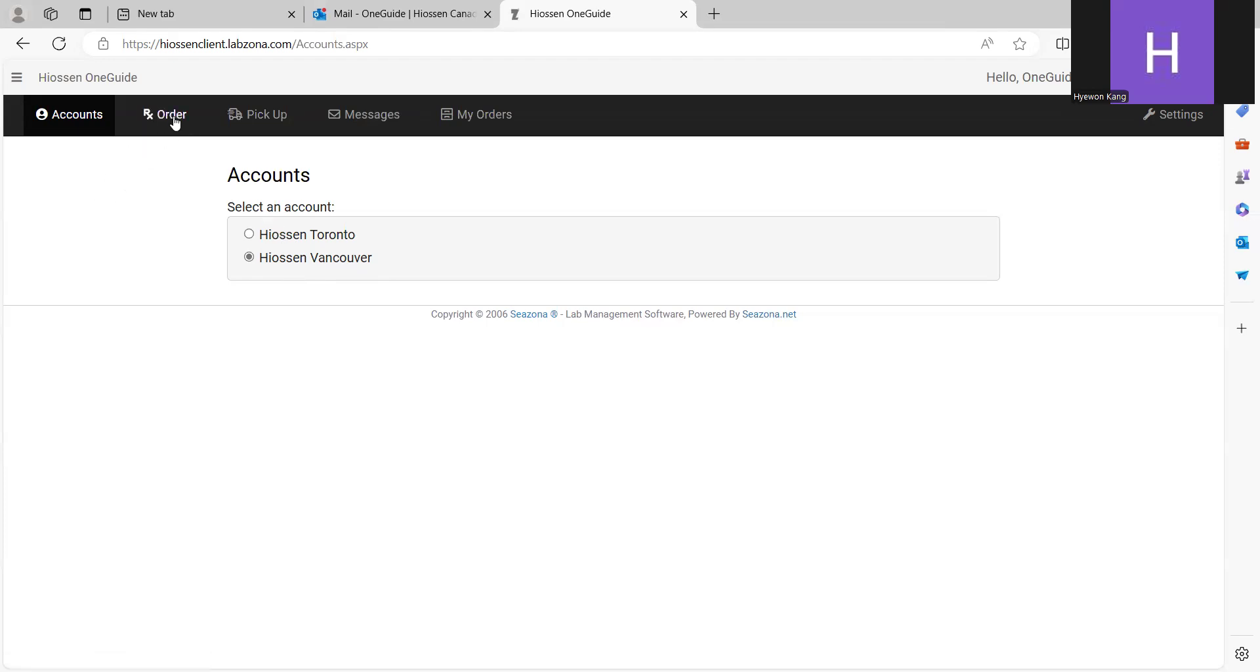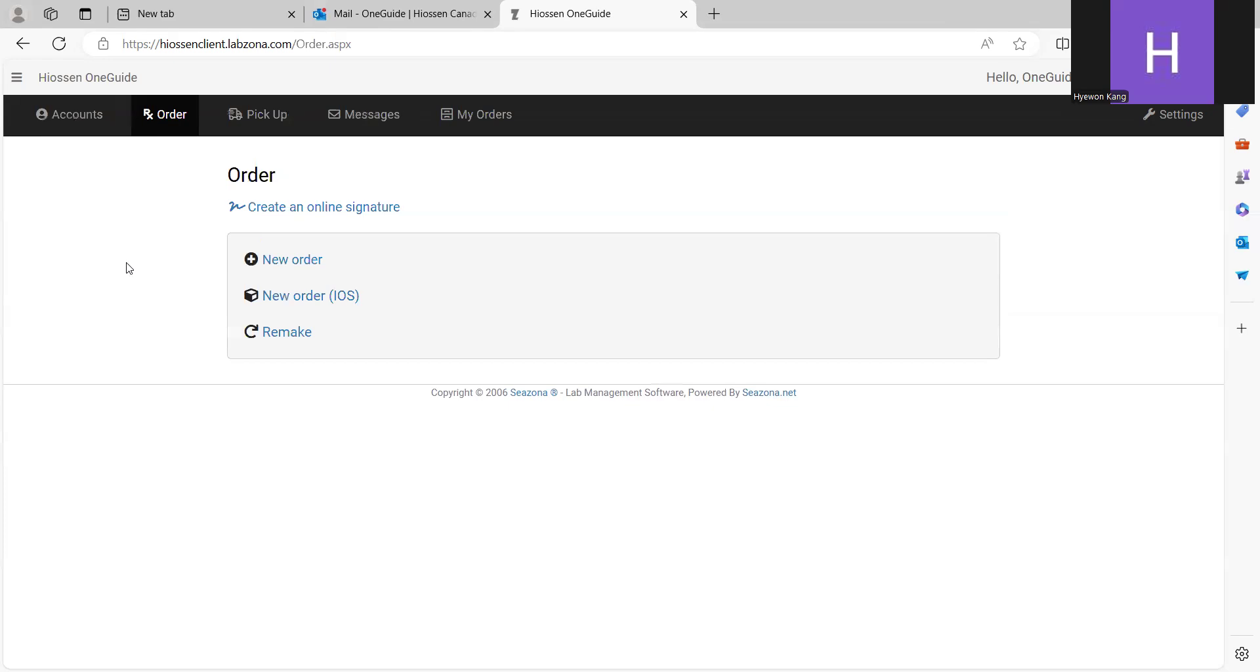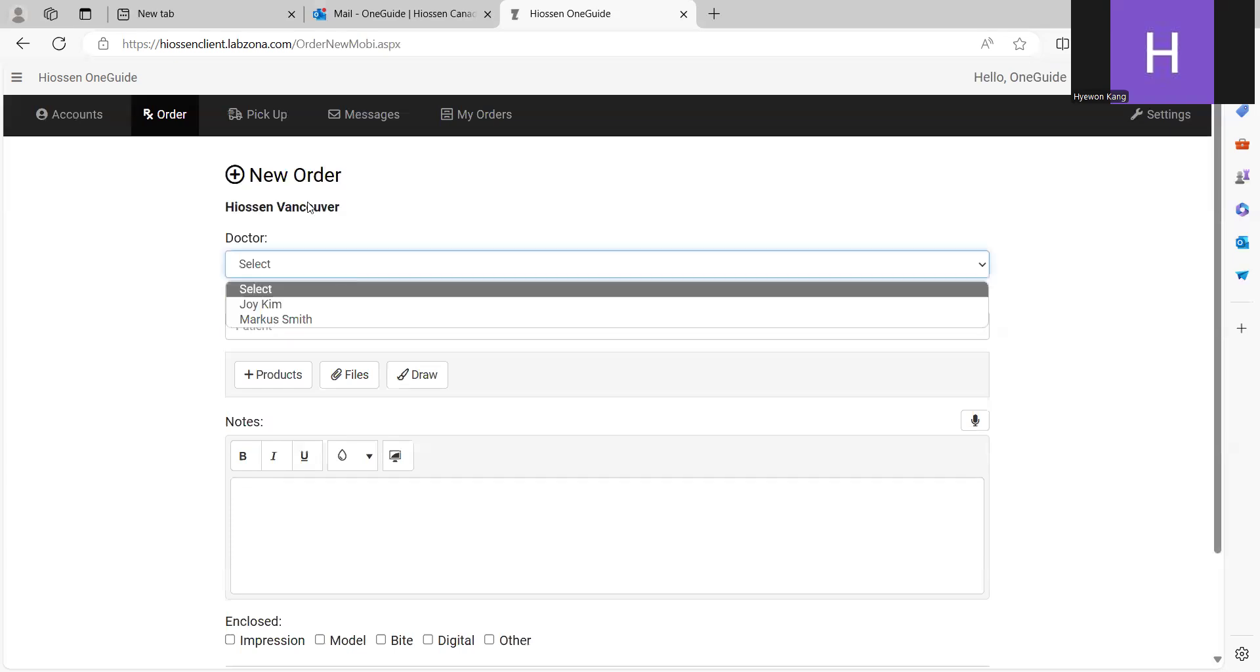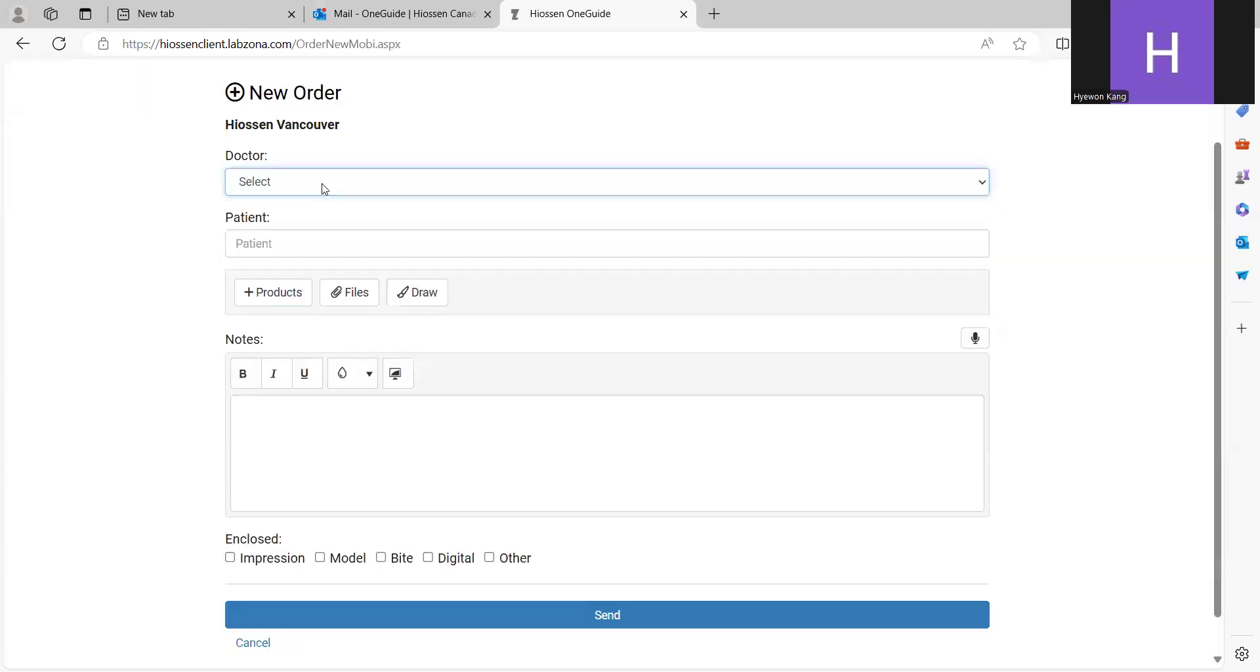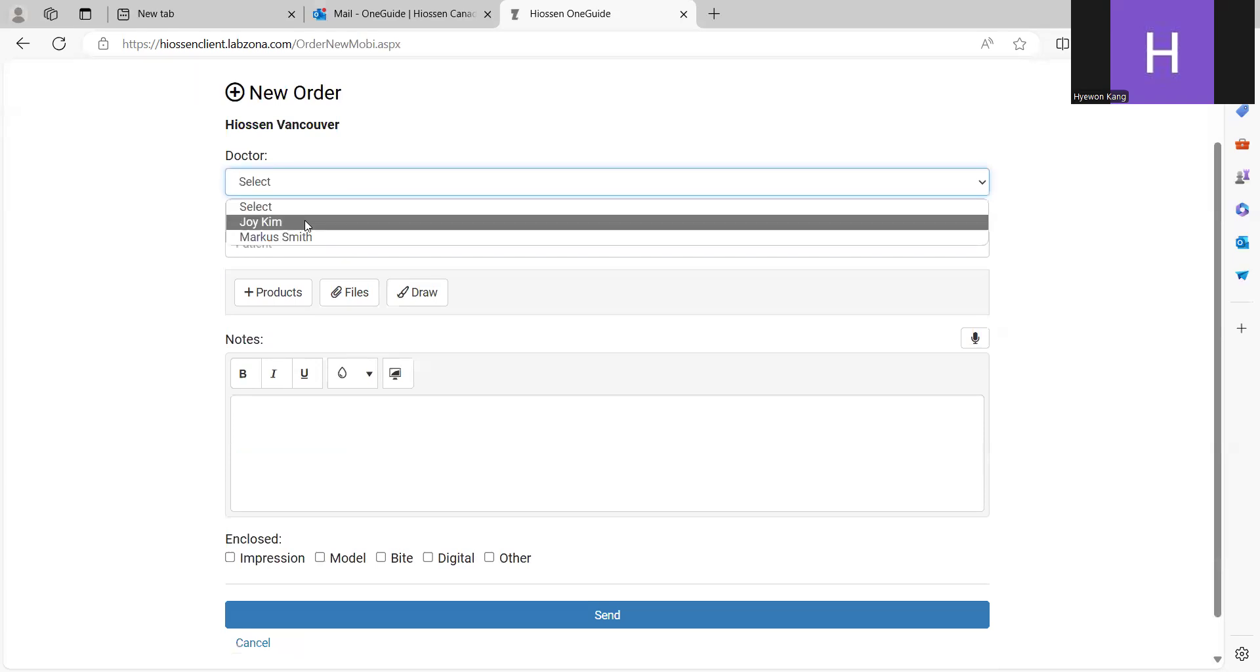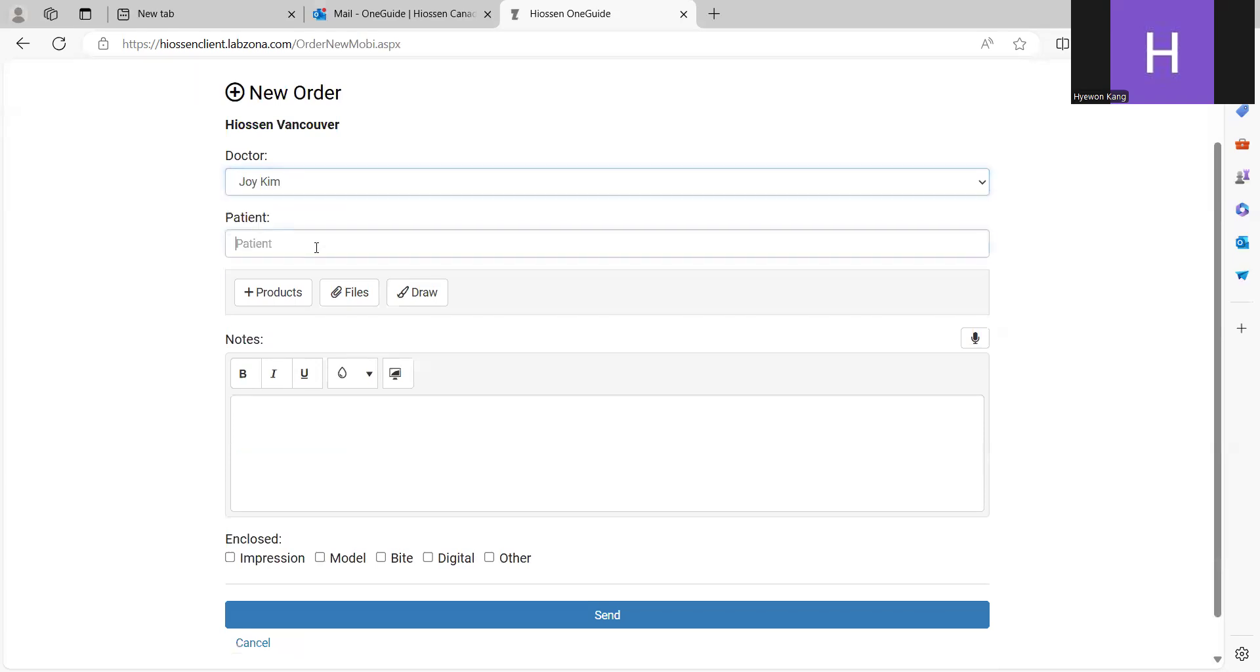Next, go to the order menu. Click the new order. If there are multiple associated doctors in the Vancouver clinic, you will see the doctor's name in this dropdown menu. In this case, I want to submit the case under Dr. Choi Kim.